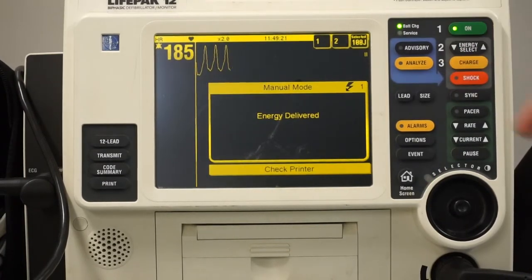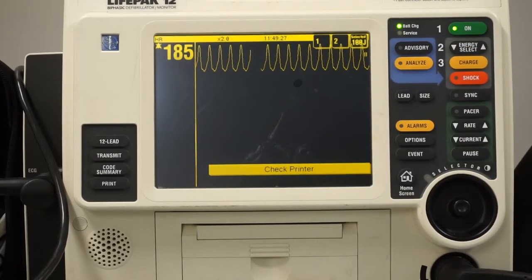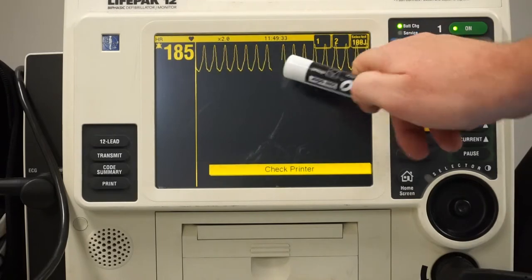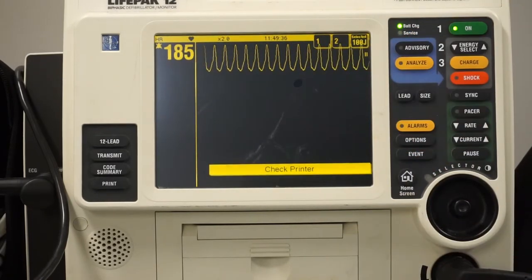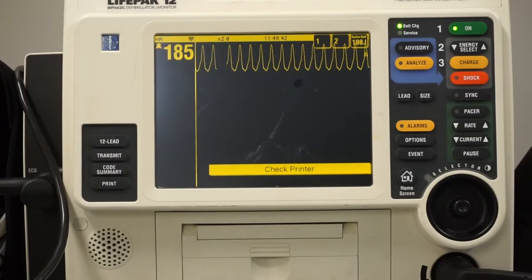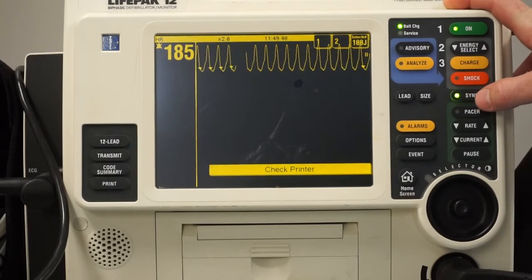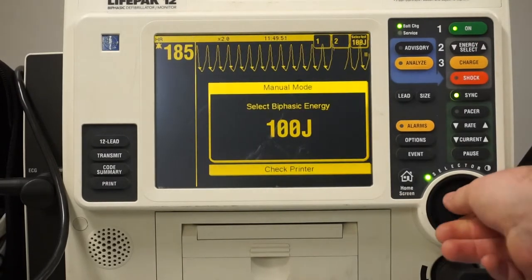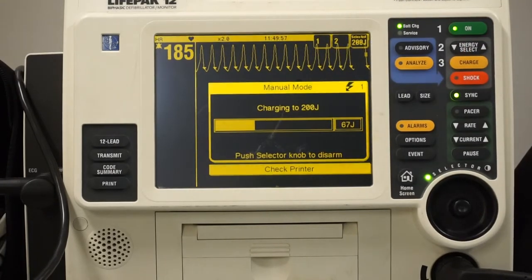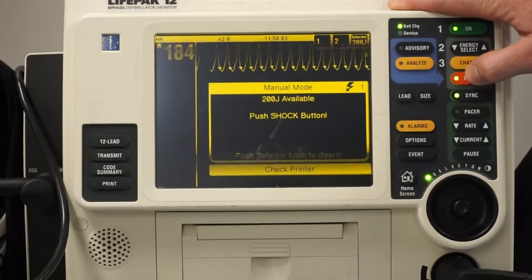After cardioversion, immediately look at the monitor. The goal is to lower the rate or break the rhythm. If the rate is still 185, move up. Depending on your protocols, escalate to 150 or 200 joules — 200 joules is the maximum for synchronized cardioversion. Go to energy select again, go up to 200, select, charge, confirm head clear, feet clear, everyone clear, then deliver the shock.